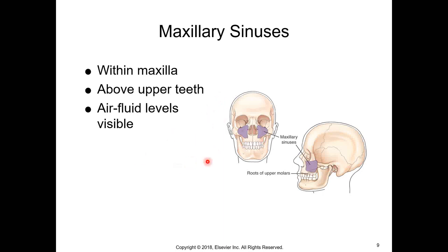And you can check for air fluid levels. They're above the upper teeth. So when you start to feel a lot of pressure in your sinuses, sometimes you can get tooth pain. That's actually a pretty common thing that happens because you can see here's the roots of your molars here. So when all this gets filled with fluid and you have a sinus infection, your teeth start to hurt.